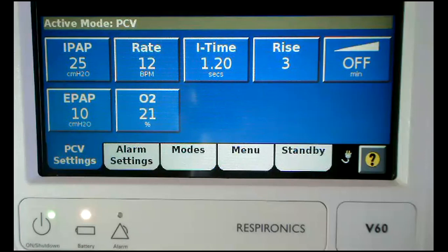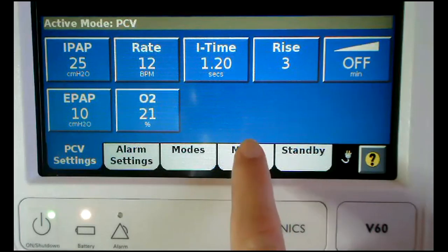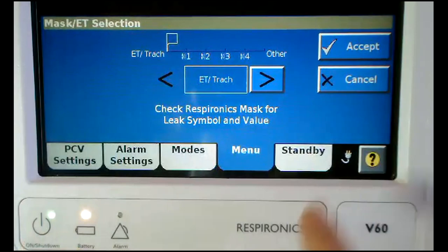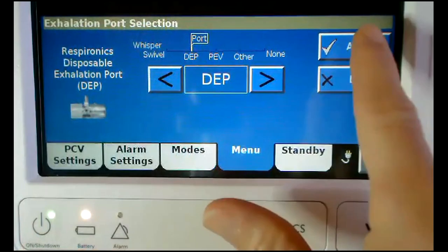In order to do this on the V60 Ventilator, you need to go to the Menu tab, Mask Port, change your selection to ET tube trach and accept. Then choose the correct exhalation port and accept.